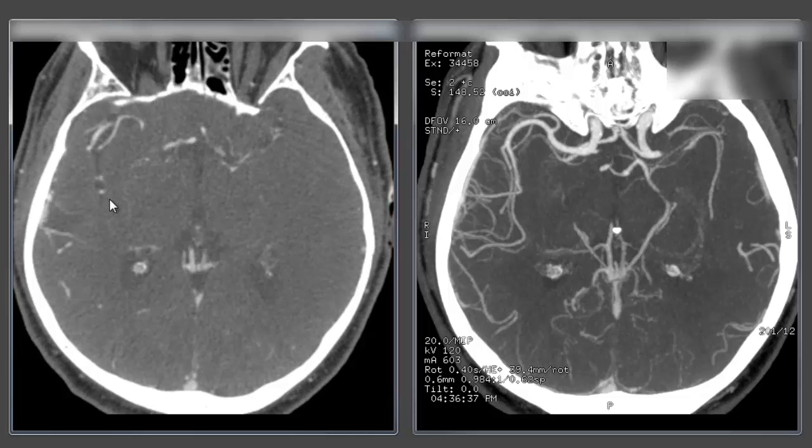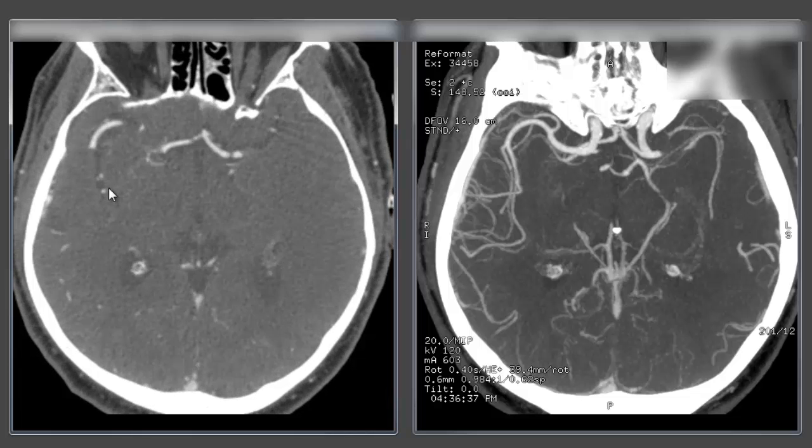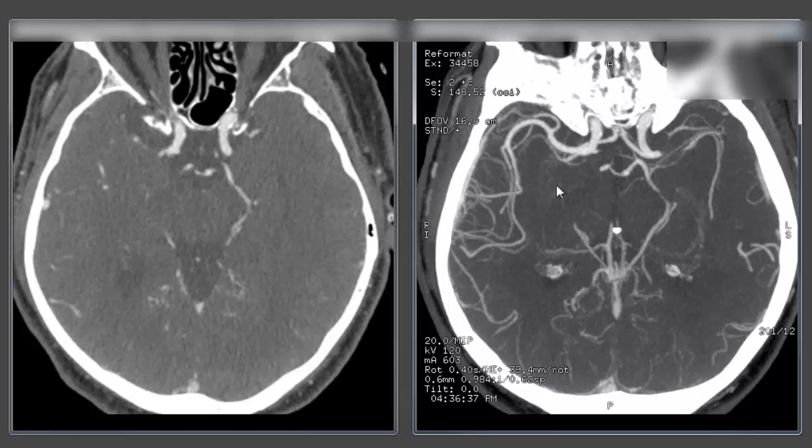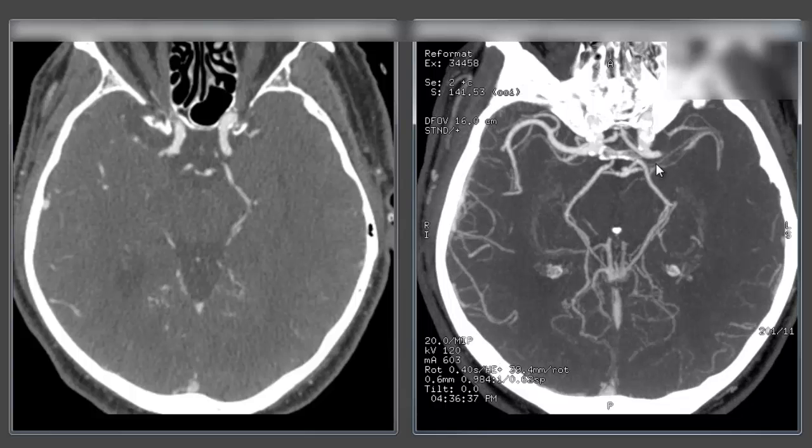It's certainly possible to do but it requires a little bit of work on our part to trace out these vessels. Yet on the thick MIPS reconstruction here in the axial plane for the same patient we see the entire extent or much of the extent of the middle cerebral artery.